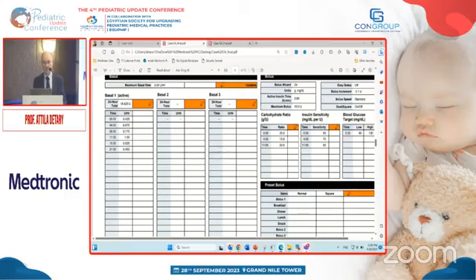The pattern is during the night less, 0.425, or after 9 p.m. it's 0.45. And during the day, it's roughly double. So this is what the physician thought would be the right basal rate for this patient. It's a little bit different than I told you, that during the night you reduce, during the morning hours you rise, and during the rest of the day you use the average, but also acceptable. It seems to work. Okay, but you do not have to complicate so much. If you just create these three levels, that's completely enough. Then we have the carb ratio setting, also the sensitivity.